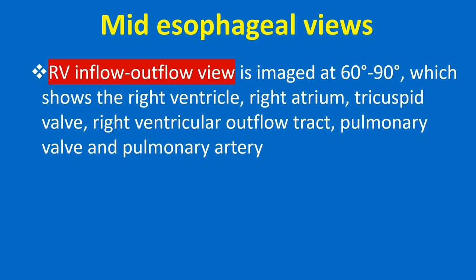The RV inflow outflow view is imaged at 60-90 degrees, which shows the right ventricle, right atrium, tricuspid valve, right ventricular outflow tract, pulmonary valve, and pulmonary artery.